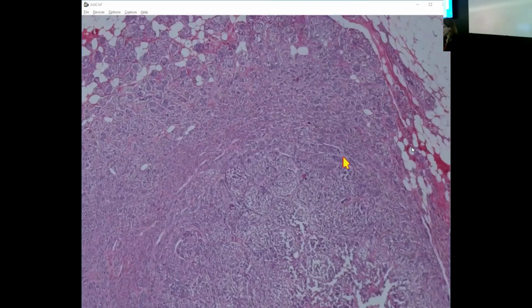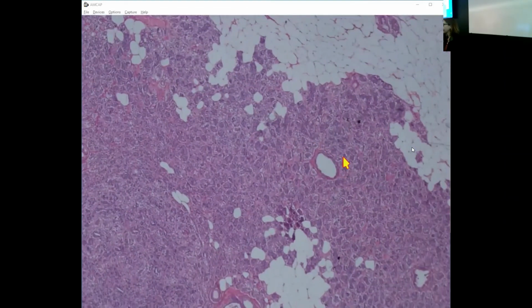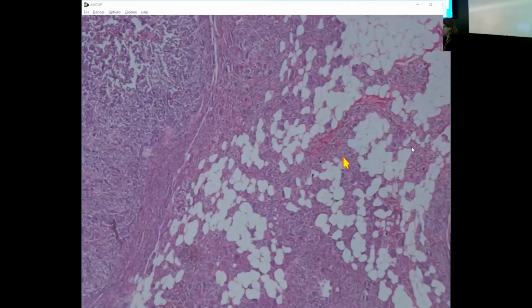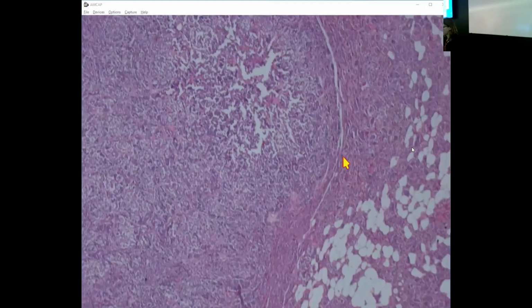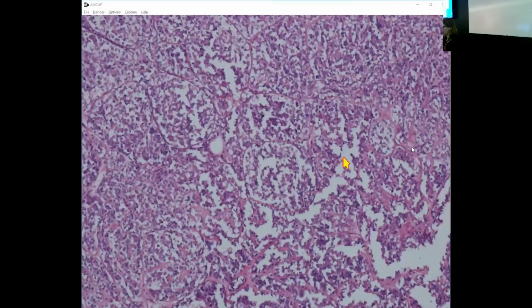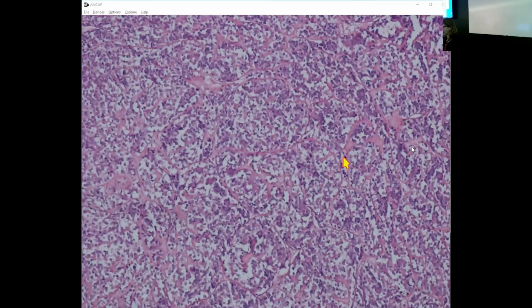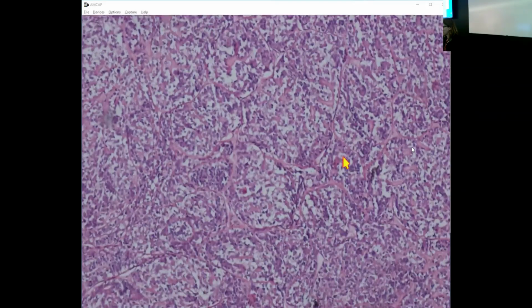And I guess it's a good question: how would you decide about epithelial myoepithelial carcinoma versus tubular variant of adenomyoepithelioma? I think if you had the more classic area of adenomyoepithelioma and demonstrated these myoepithelial cells, determination of atypia could be problematic.